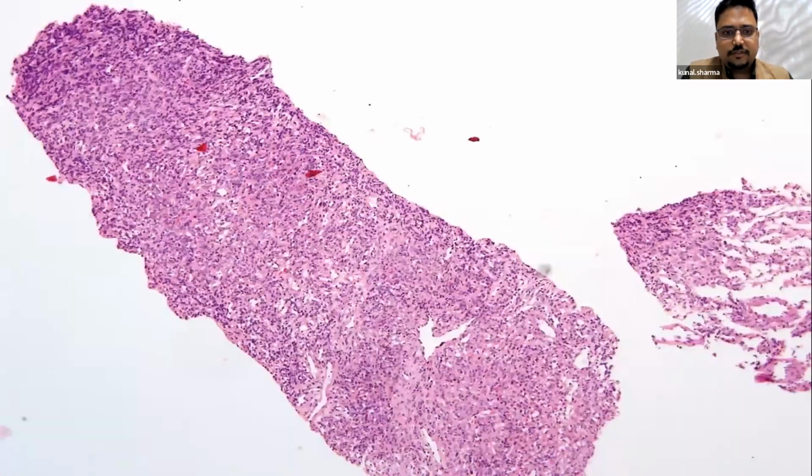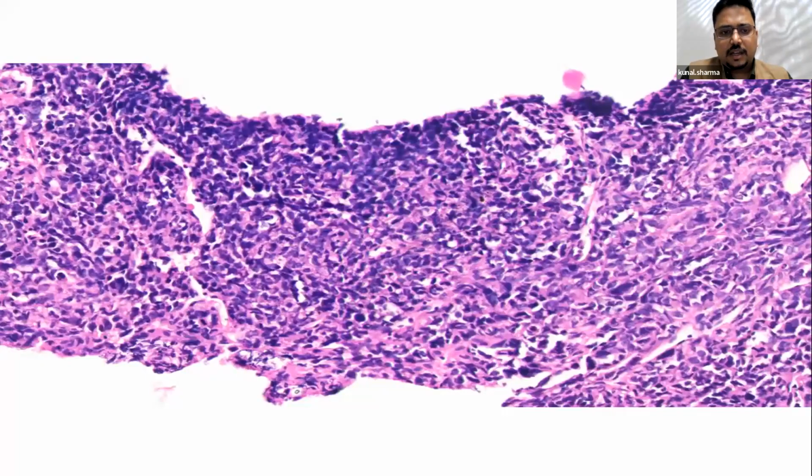On histomorphology, on lower power, this did not look very aggressive or very dangerous, but it did look like something that could be mesenchymal, could be epithelioid. When we went a little higher, we could see these really closely packed cells. Some of these were ovoid to short spindled in shape. On the higher power, you could appreciate pretty conspicuous anisonucleosis and nuclear pleomorphism.